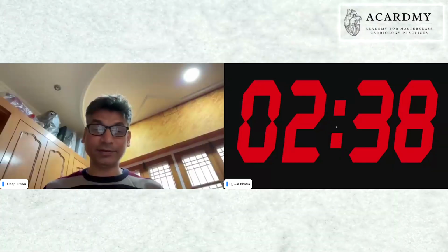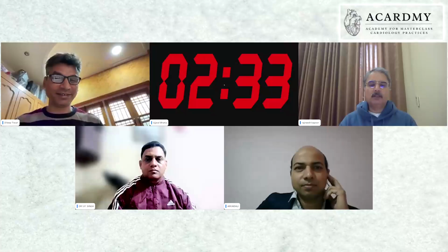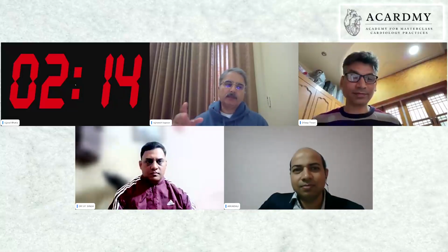Well, thank you, Dileep. This was a tremendous case. I think it requires guts to continue once you are not entering the right path from the beginning. And I could see your false lumen was a very big length, not a small false lumen. And you still stuck to that and kept trying different wires.